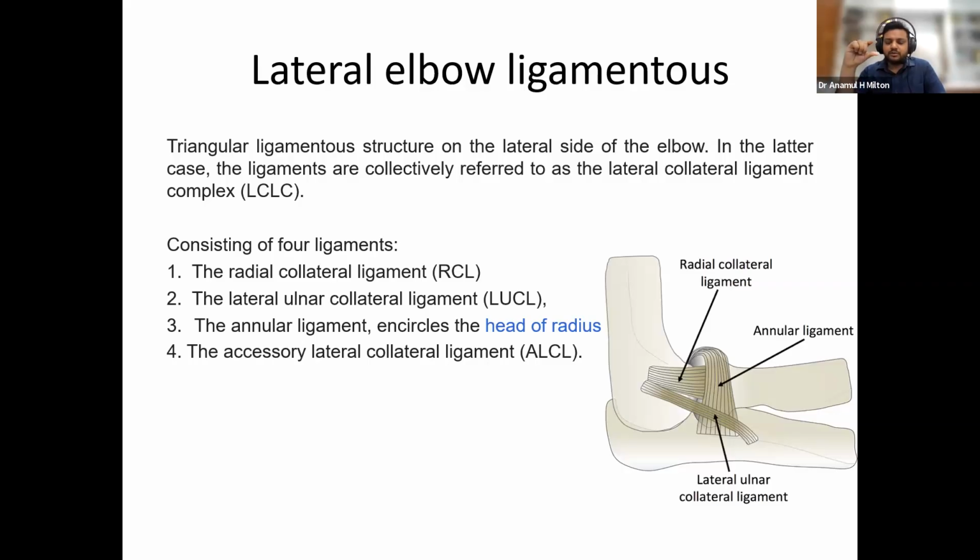We already know that a ligament is the connection between two bones. If these bones are in the same plane, the ligament is not seen so well. If there is any injury, we need to stress these structures. When stressing them, we can see the ligament's total length, its structure, any thickening, the pattern, and if there are any abnormalities, we can see them very easily.